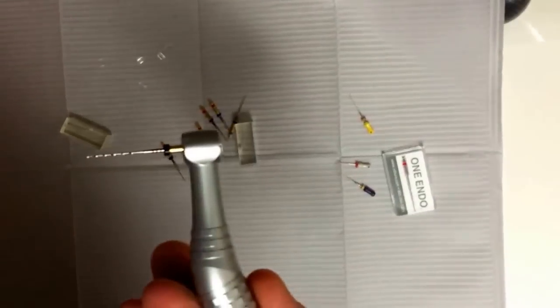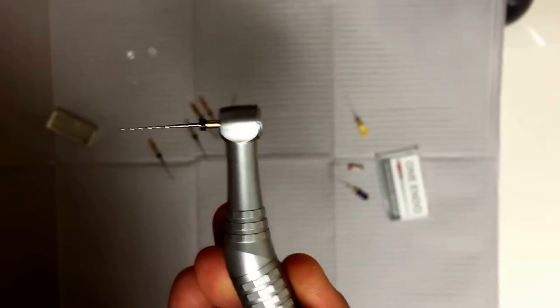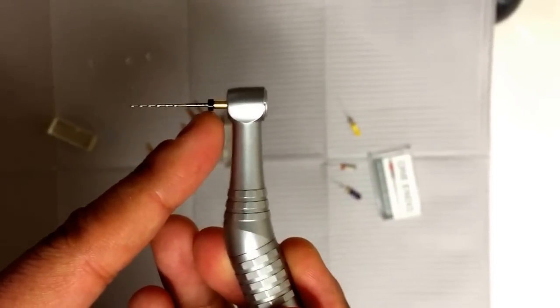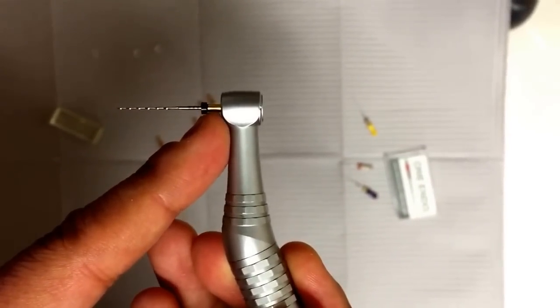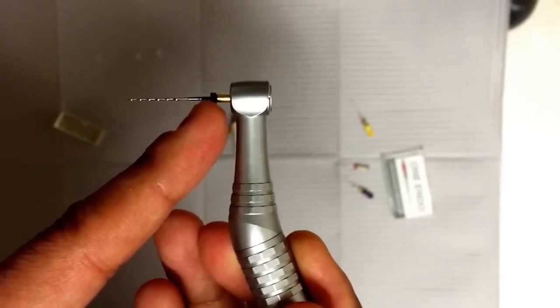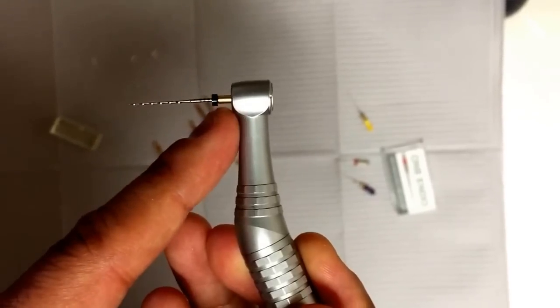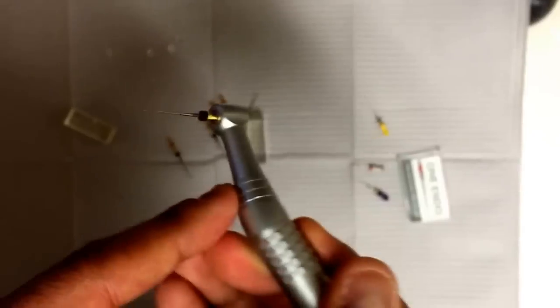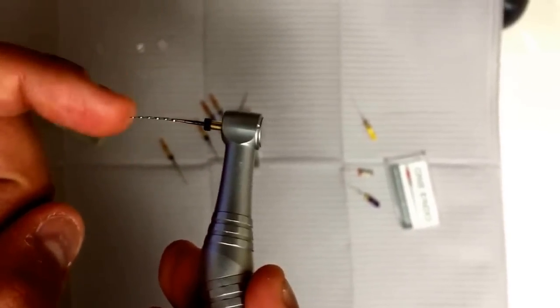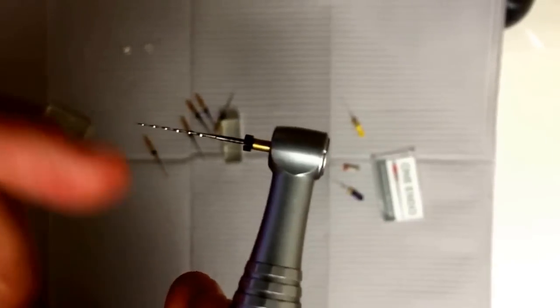That's kind of what it looks like. I'm not a fan of this extra handle length. That's why I like the Vortex, the K3, and the Edge Endo, where that extra little shank is not showing — so for smaller mouth openings I can get in. This is definitely not the heat-treated version of the rotary. You can see it's pretty stiff.